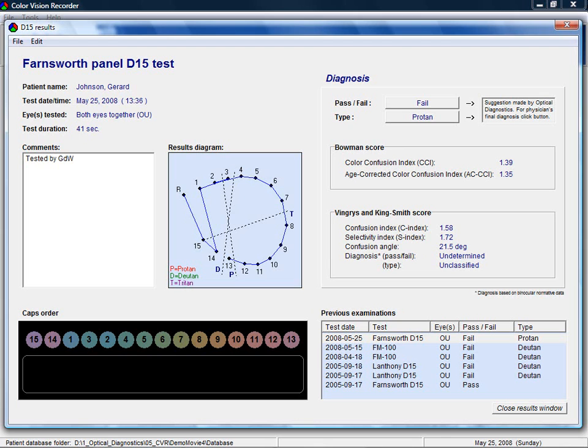For D15 tests, the software shows the well-known horseshoe diagram. It also calculates color confusion data based on the Bowman method and on the Vingrys-King-Smith method.